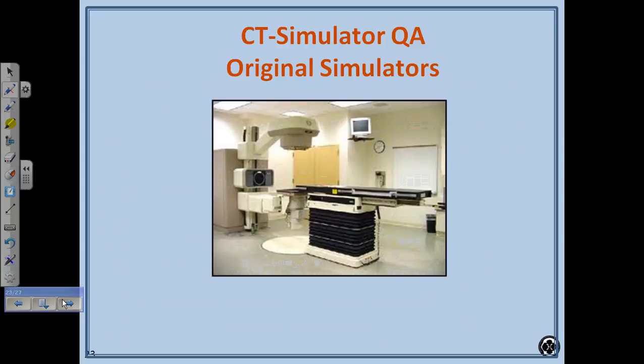Okay, CT Sim QA. All right, so now we're changing gears. I've got an old-fashioned sim. You guys ever seen one of those? Yeah, they had one in Kentucky. They did? Really? Yes, and they use it for emergency patients. Oh, okay. Yeah, it's quick and dirty.